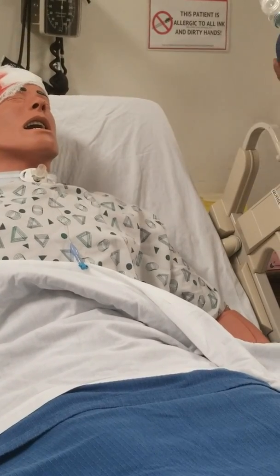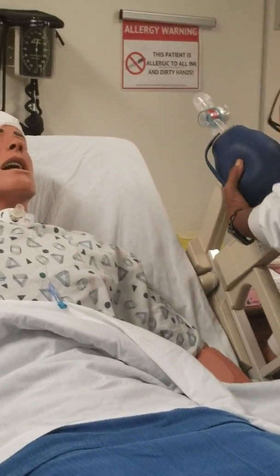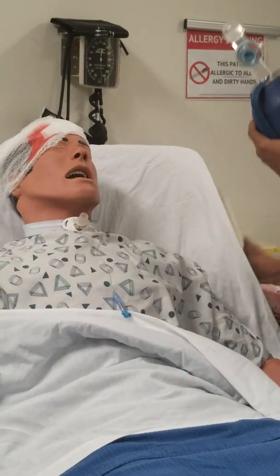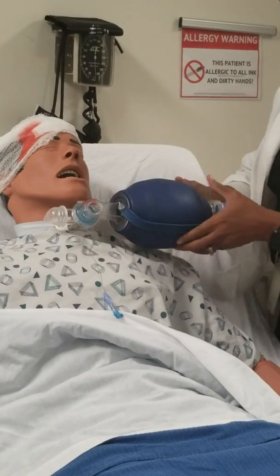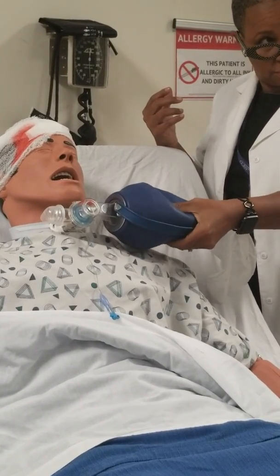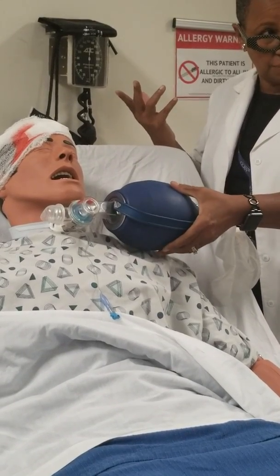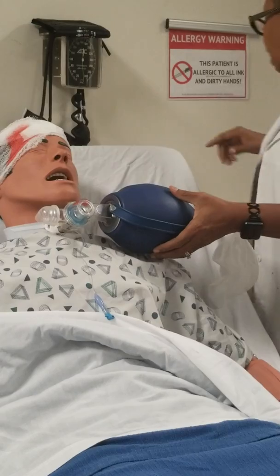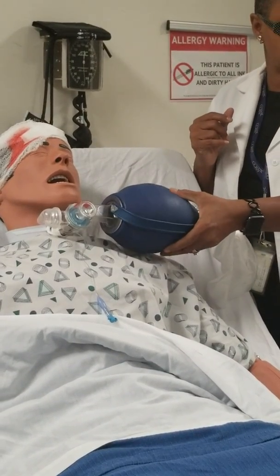This will be attached to an oxygen cord here, and you turn your oxygen up to 15 liters as the flow rate. You take this in here, you attach it to here. When he inhales, this is how you hyperoxygenate him if he doesn't have a collar, okay? If he's on a ventilator, I can possibly just hit the button and give him 100% oxygen, okay?